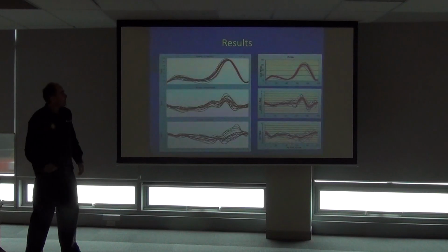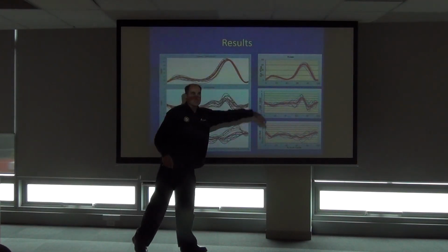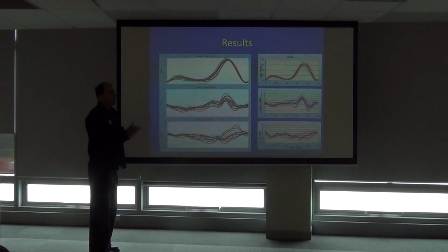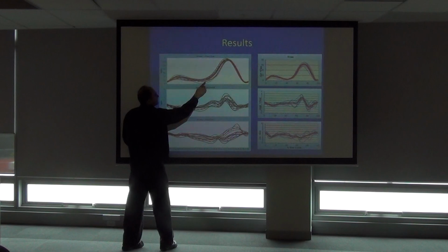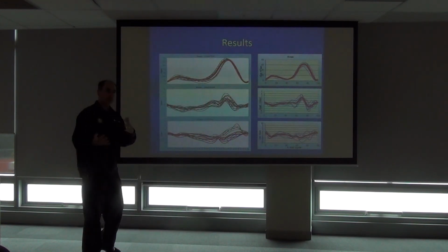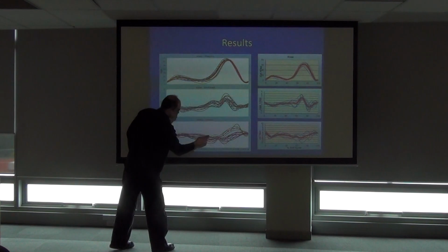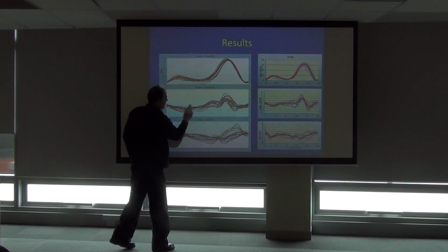Okay, and if we look at the knee, that was just putting that up, that was just a comparison, the whole lot. Mean of 10 after correction and my 10 here. The knee, the same thing's going on. We seem to have groups here. There's the mean, the red. We have a group below, a group above. Increased, reduced flexion, and same here. And it shows up in abduction adduction as well, and internal external rotation. Above and below the mean.